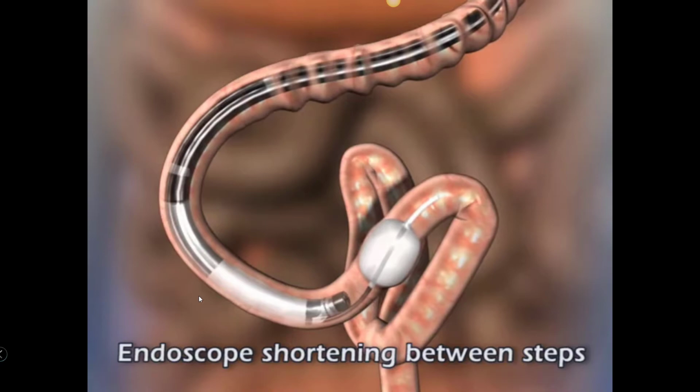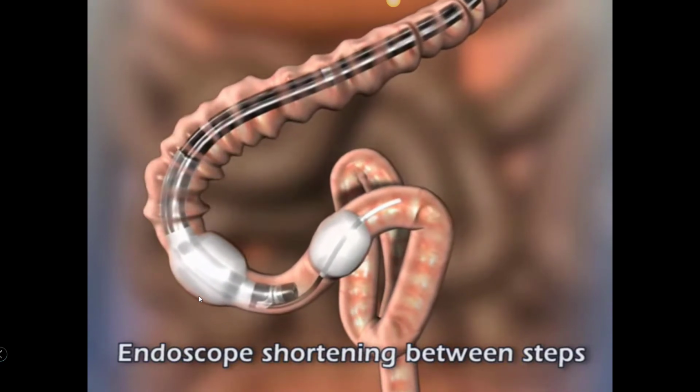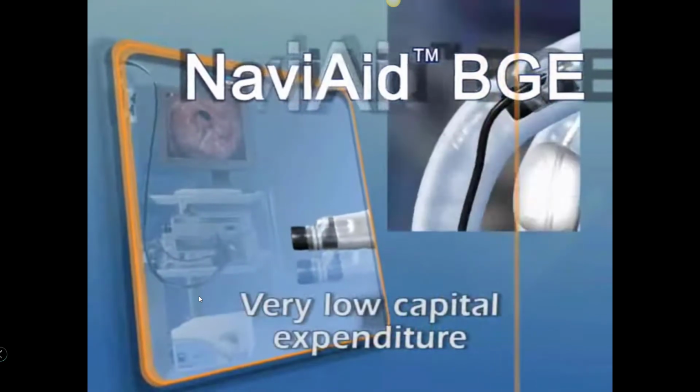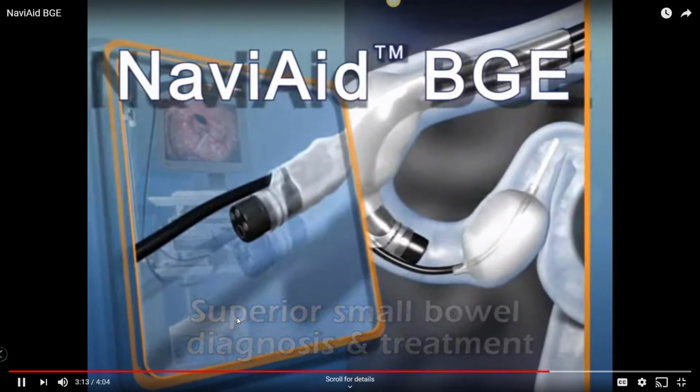Following a BGE step, the endoscope may be pulled and shortened with the rear balloon inflated. The NaviAid BGE affords low-cost and superior small bowel diagnosis and treatment.